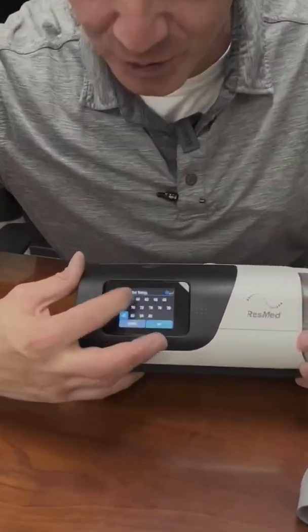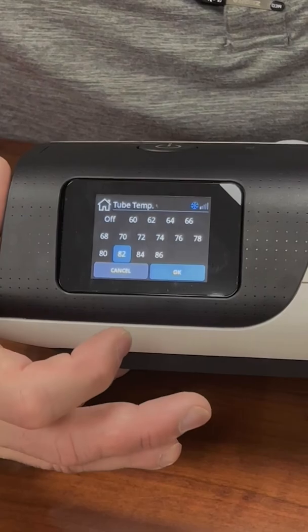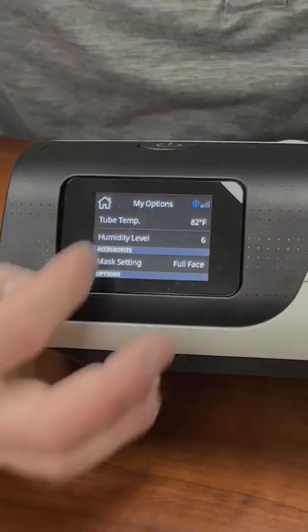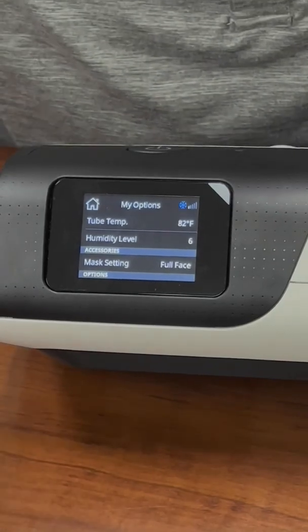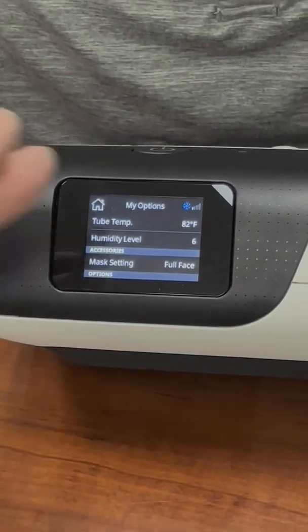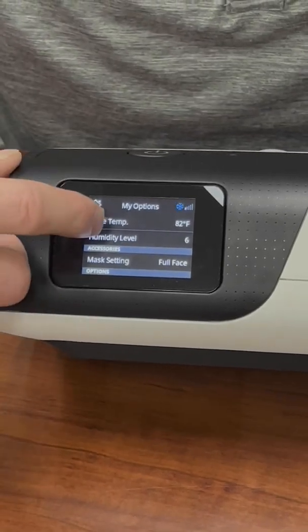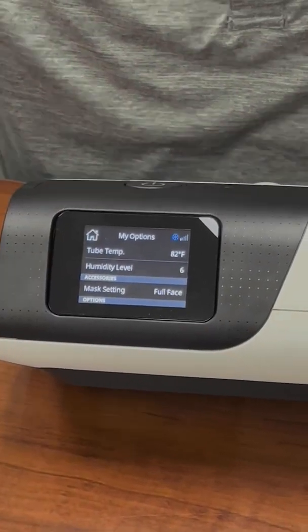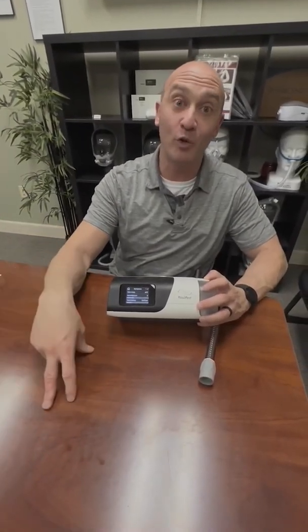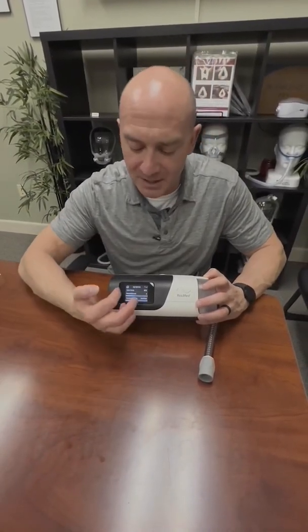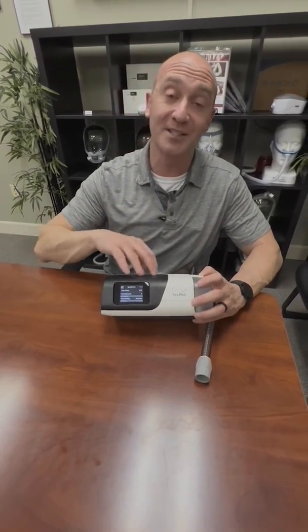But if you do want to get a little bit more humidity, you can go up to 80, and that's keeping that tube warmer, so you're getting less opportunity to have condensation in there. Usually what I'll tell people is, if you're getting dry and you've got this set, increase your humidity level, but then also increase your tube temperature by either 2 or 4 degrees.